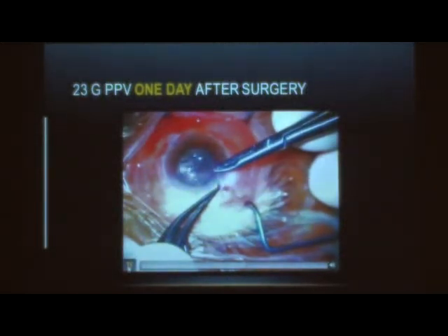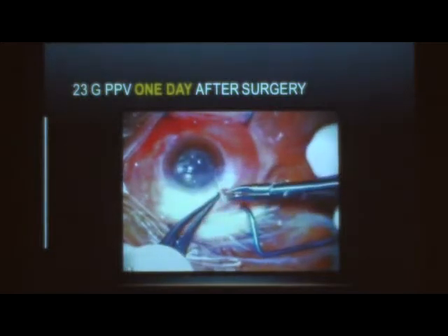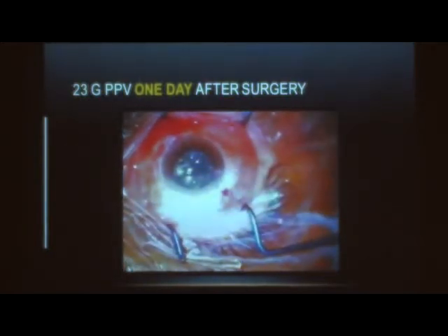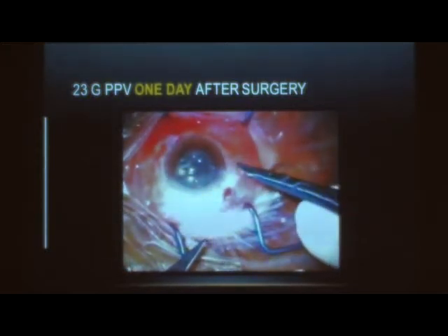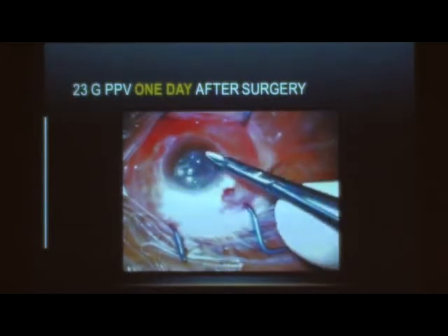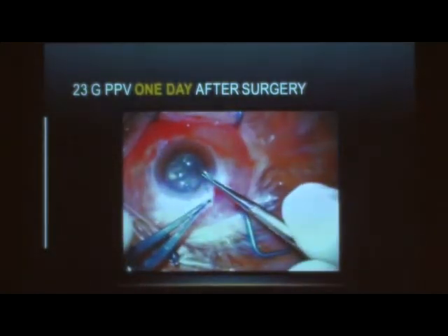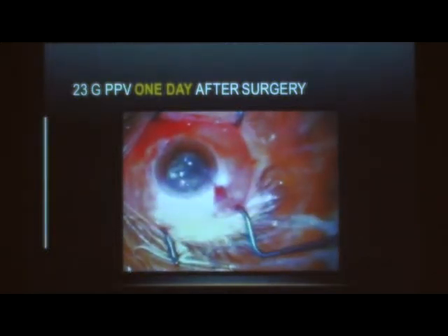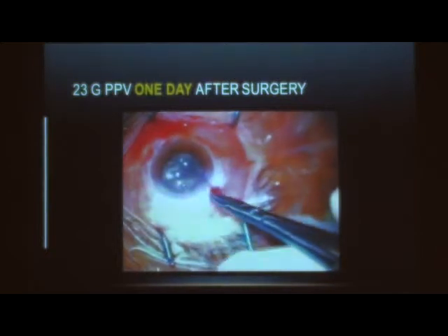So this is an example of a patient that was referred the second day after cataract surgery. He was nicely managed by his cataract surgeon. There were dropped nuclear fragments and cortical matter. He put a 3-piece IOL in the sulcus. He did a good anterior vitrectomy, but he did not suture the corneal incision. First thing I did is to put a 10-0 suture to ensure the integrity and the formation of the AC. I don't want a lost AC. I don't want the IOL to be mobile.